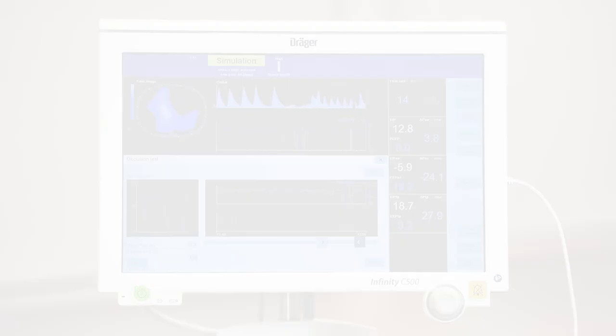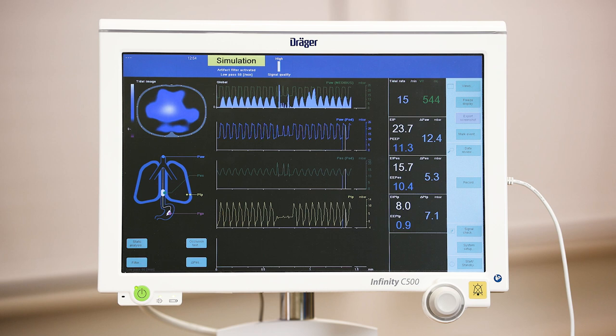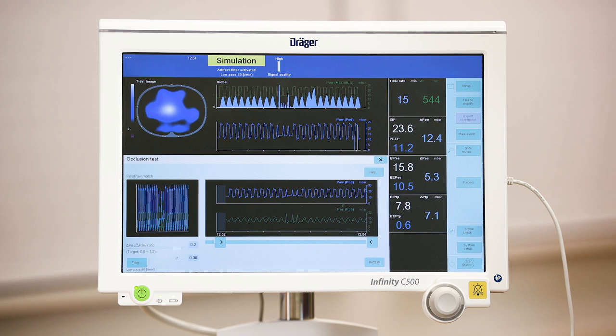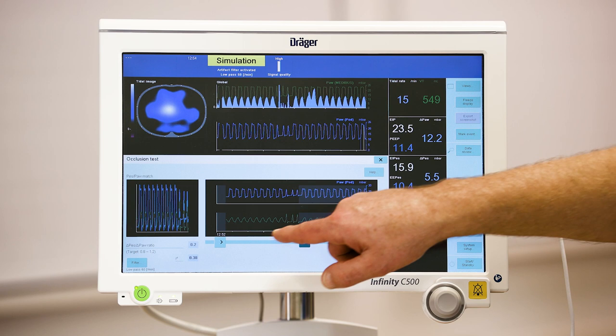For sedated patients, apply external manual chest compressions. Use the sliders to mark the occlusion phase, which should now include positive swings caused by the compression.